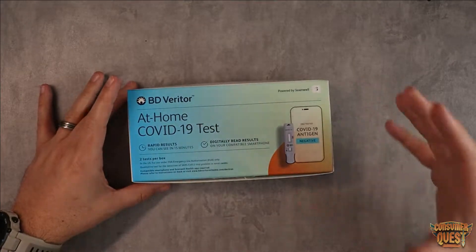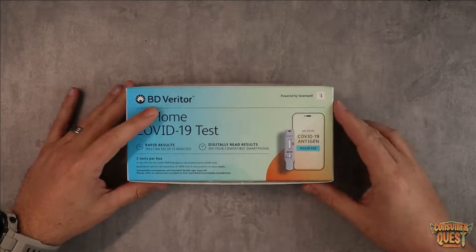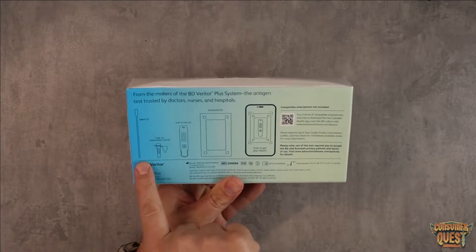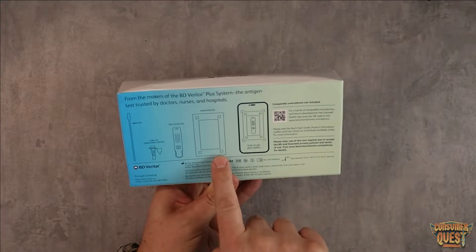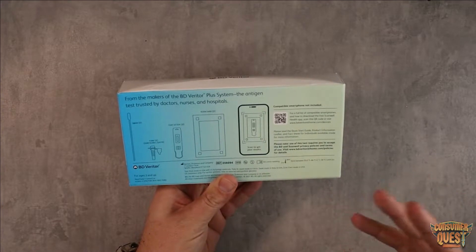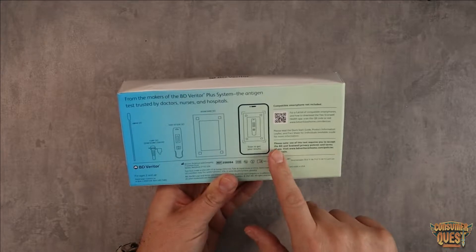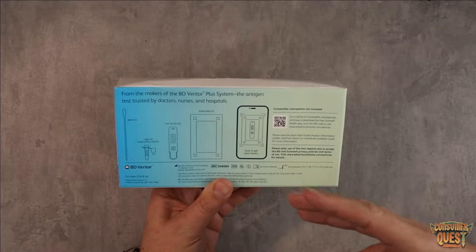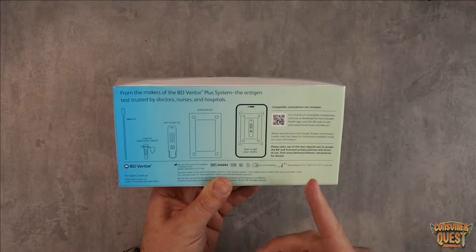Let me show you in this video what is in the box. So this is the packaging here, this is what it comes like. You're basically going to get a swab, the test tube, the test stick, a scan card, and then you can get the app which is available on iOS and Android. If you click this QR code with your phone, you can actually see which devices are compatible to make sure yours is.